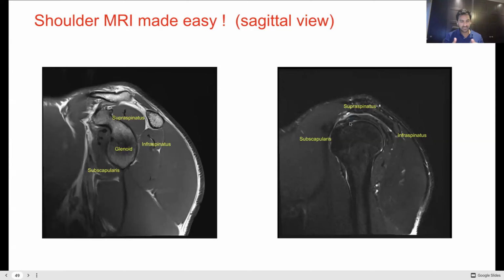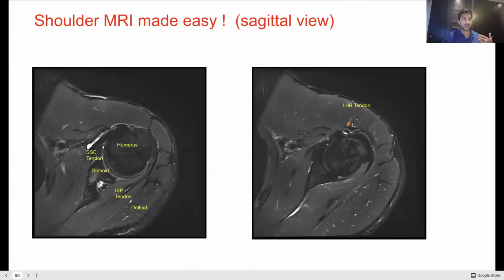So once you realize these are 2D representations of 3D structures, and you think about it like a haircut style, it starts to make sense. When you're scrolling through, you start to see areas that are missing, and that will tell you what kind of tear it is: full thickness, partial thickness, full width, and what surface, bursal surface or articular surface. And then that will start to make sense. And next time you read a report, it will make more sense as to what part we're talking about.